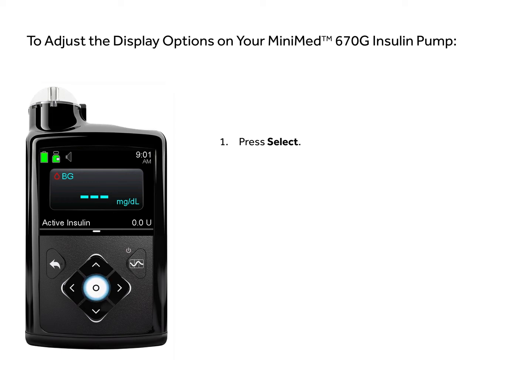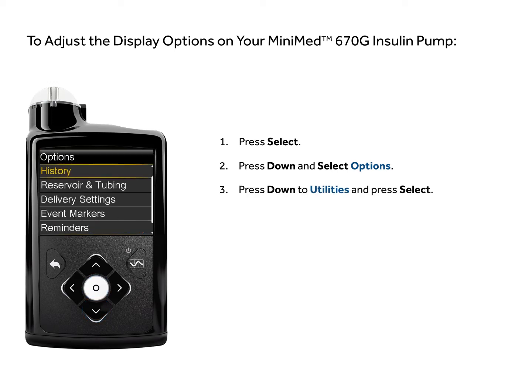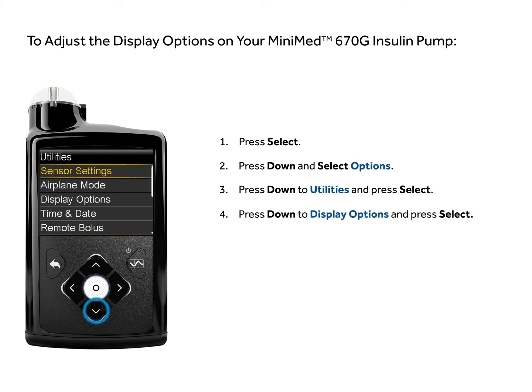Press select, press down and select options, press down to utilities and press select, press down to display options and press select.